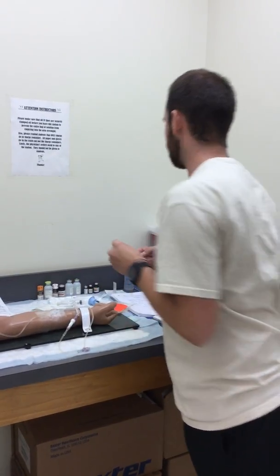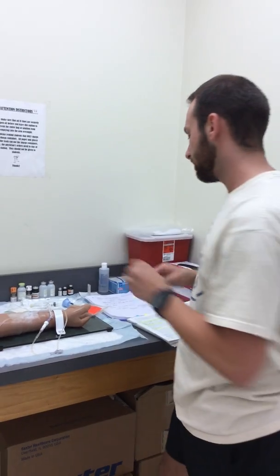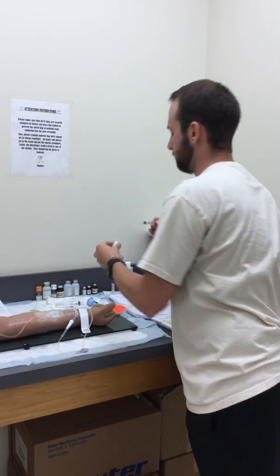Okay, for our digoxin, we're going to pull up 0.5 milliliters, and you give that over 5 minutes, so you would do 0.1 milliliters a minute. I'll go ahead and pull that up.